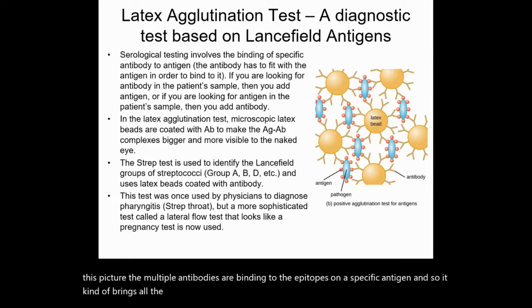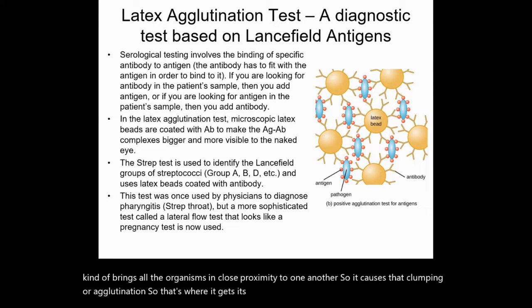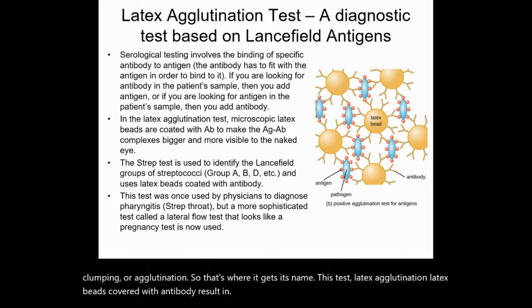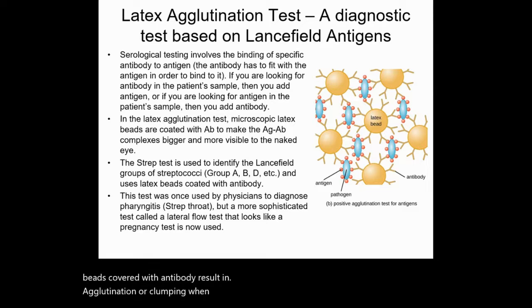And so it kind of brings all the organisms in close proximity to one another. So it causes that clumping or agglutination. So that's where it gets its name, this test, latex agglutination. Latex beads covered with antibody result in agglutination or clumping when the antigen is present.